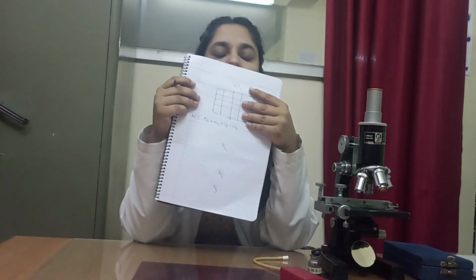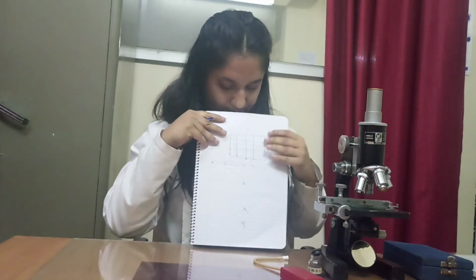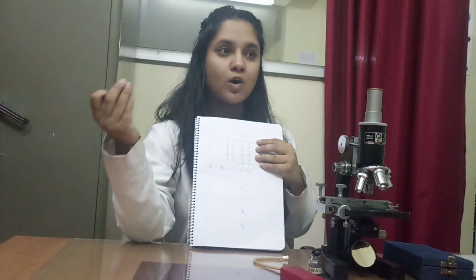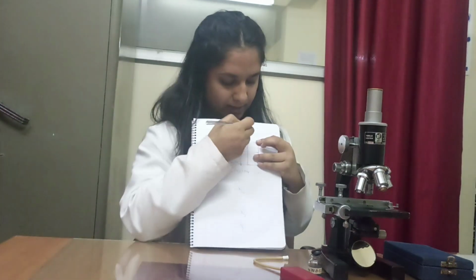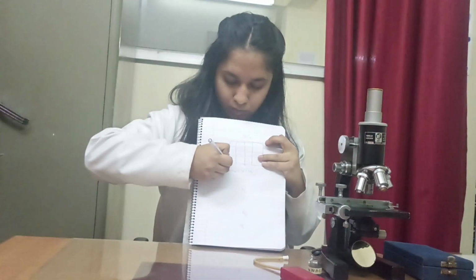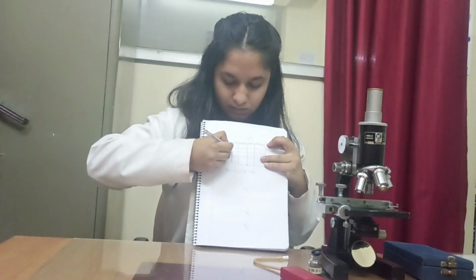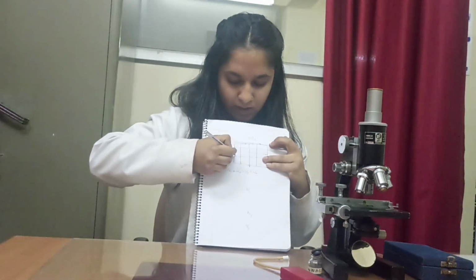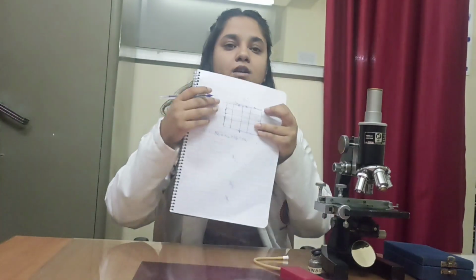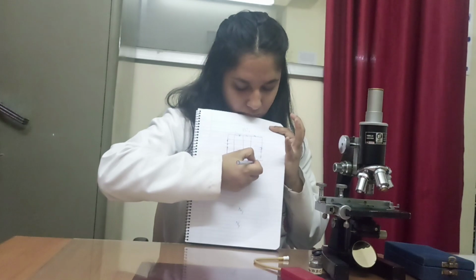After this, before we check these chambers, we should know some rules on how to calculate the WBC chambers. In this border and this border, there are some WBC cells present. These borders should be counted in WBC counting. These borders are counted, but these two borders are not counted.